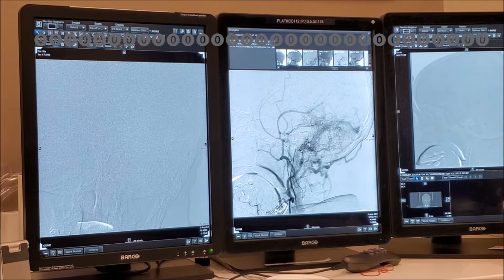Okay, now you see definitely what's this one? Sorry, which one? This one. Oh, the MMA. And how do you know that? Because it's got the straight channel as it goes through foramen spinosum. Which is right there, right? Okay, you see this branch, how dominant it is. Now you see a network. What is this? Arteries or veins? What am I looking at here? I can't really delineate it because my contrast injection's too long. Okay, so we're going to do a third injection.